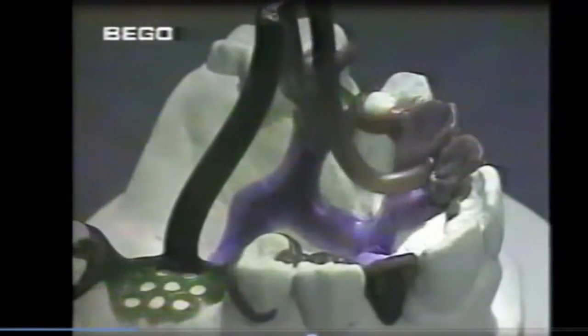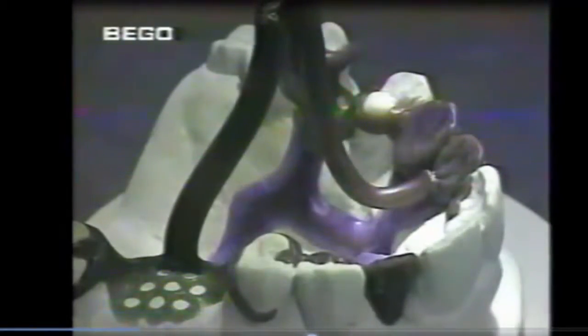To achieve a perfect casting result in this case as well, thick parts, like these backings in the anterior area, are provided with an additional 3 mm sprue.